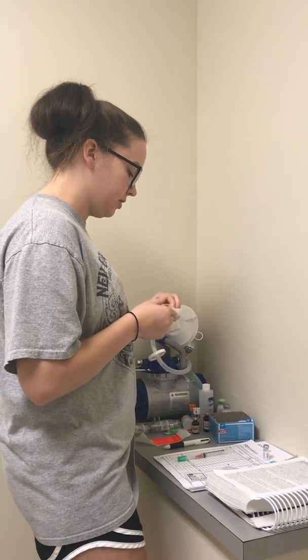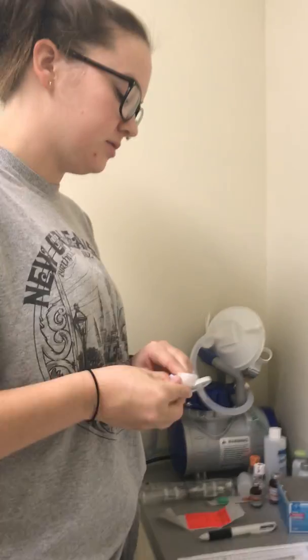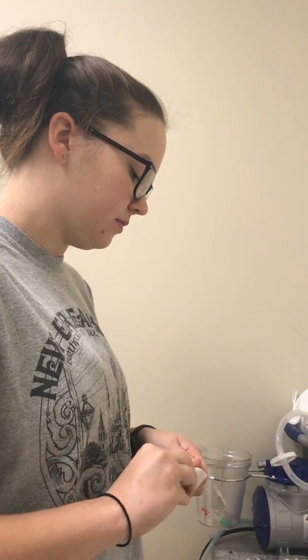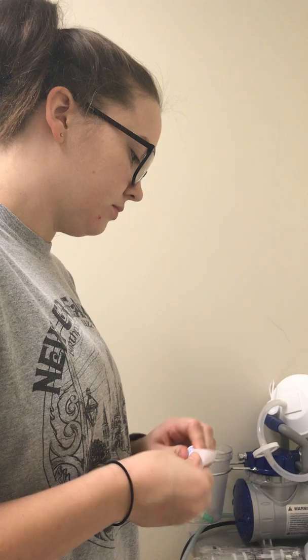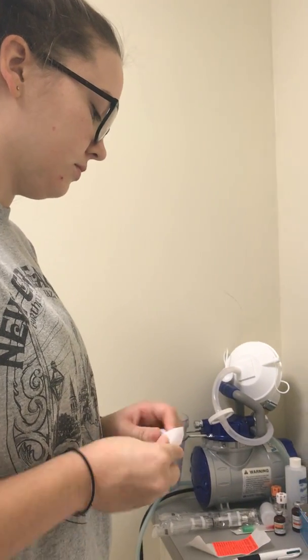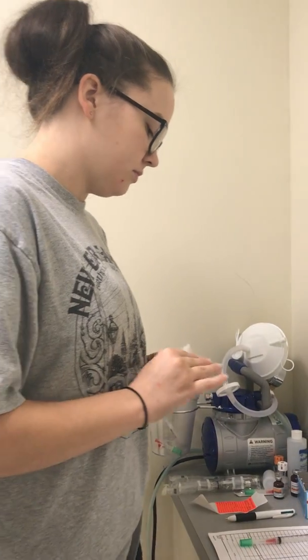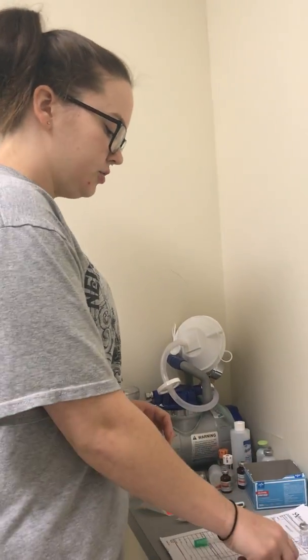Going to scrub the hub of my medication for about 15 seconds. Okay, allowing that to air dry.